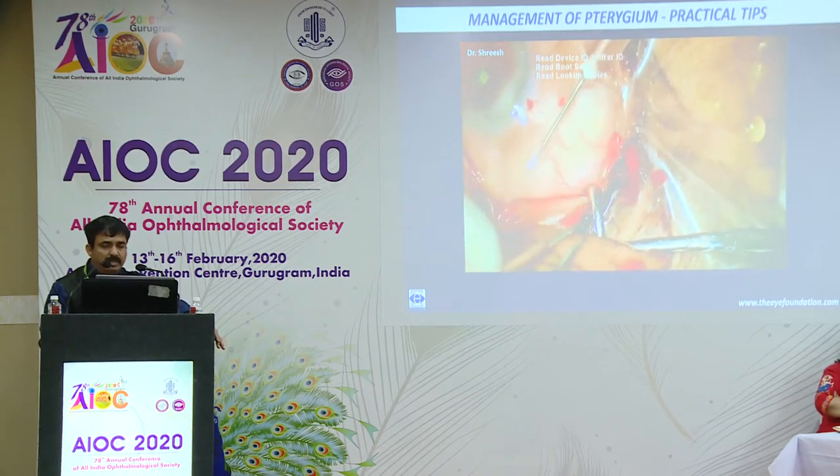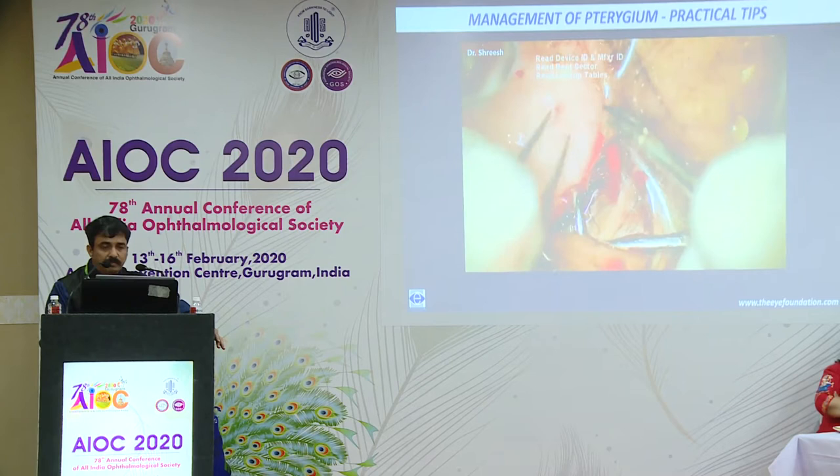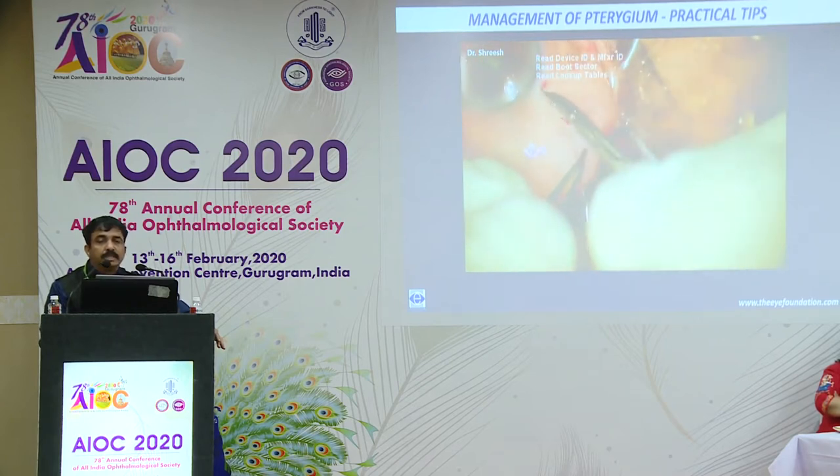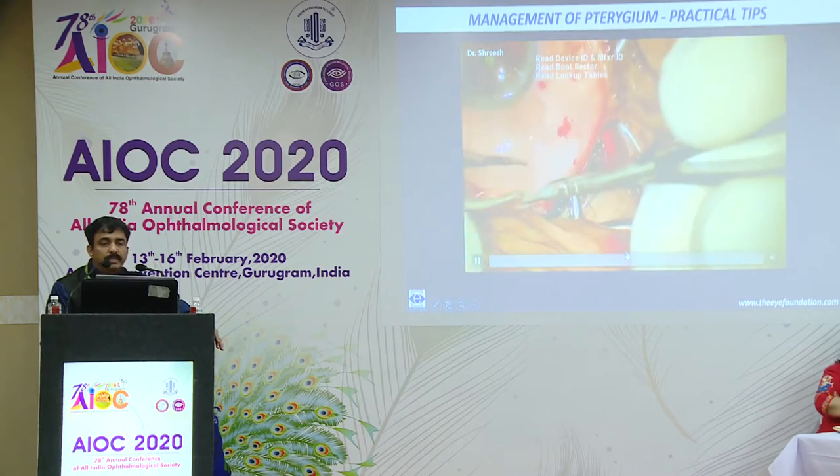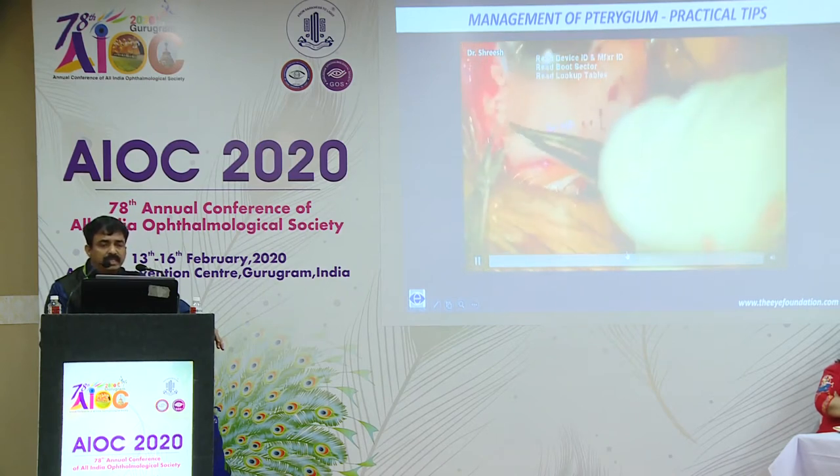Take a graft from the superior or superior temporal bulbar conjunctiva, and usually inject lignocaine subconjunctivally to separate the conjunctiva from the underlying Tenon's, and take a thin graft.